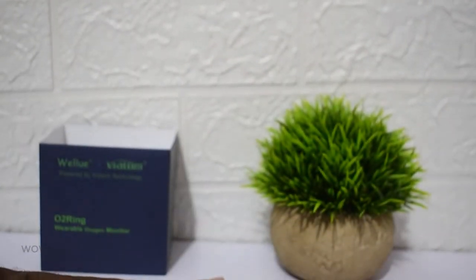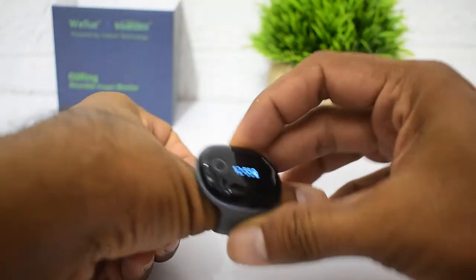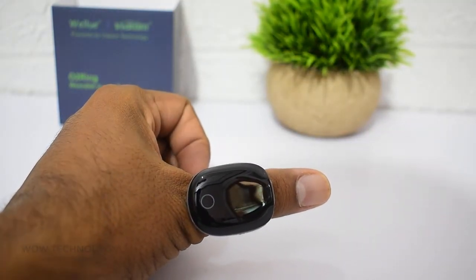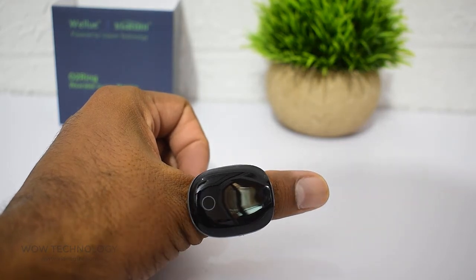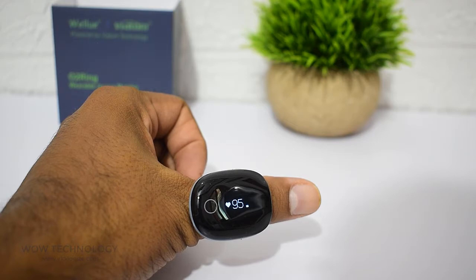Simply place the ring on your thumb or index finger. As soon as you do so, the capacitive sensor inside detects contact with your skin, the device powers on automatically, and then after around 5 seconds, you get a readout of your SpO2 and heart rate on the device screen.